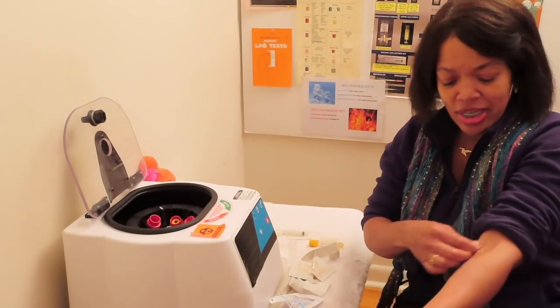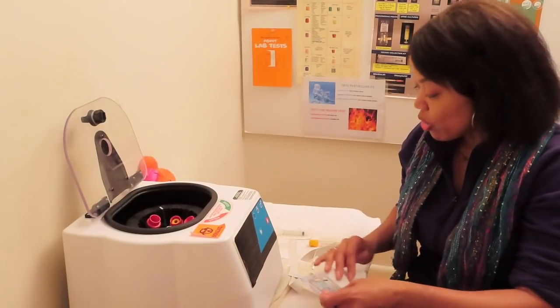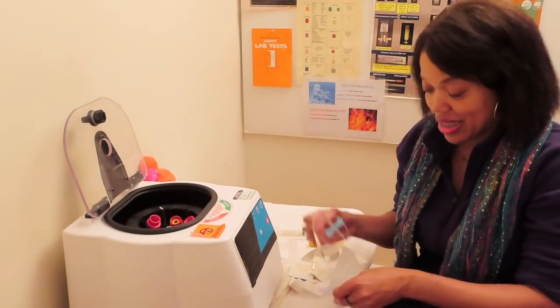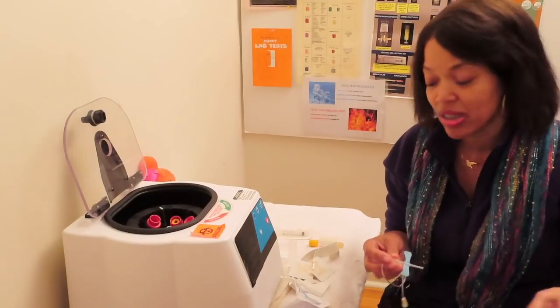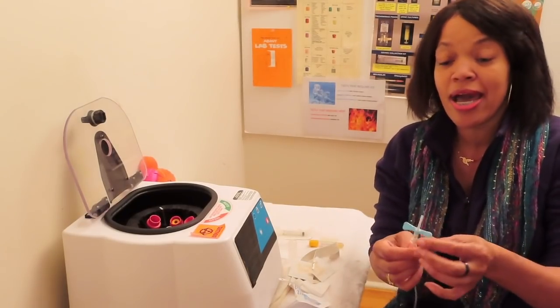You know, this is the perfect setting if you guys had someone sitting. You've got everything you need and what you are going to do is to commence to sticking. Now, I'm sticking myself. I don't have gloves. I'm not even putting on a tourniquet because you guys already know how my veins work.